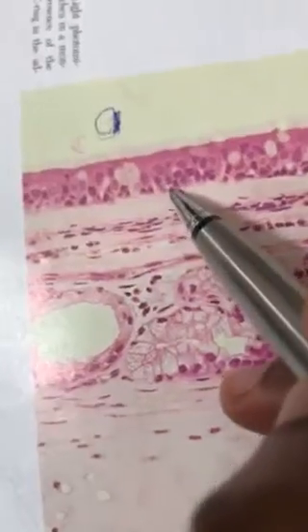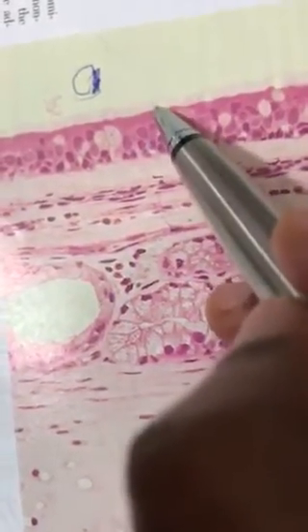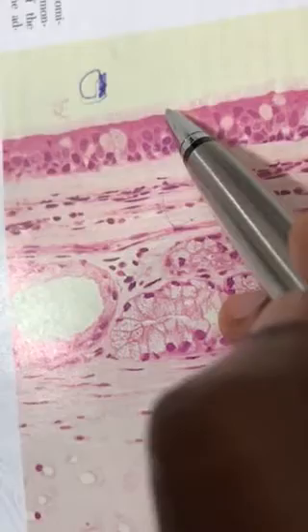Next is the trachea. Trachea is most important. When you see the trachea, we will ask you what is the lining. That is the pseudostratified ciliated columnar epithelium. What is cilia? Cilia is a surface elevation from the underlying cytoplasm. So this is cilia. What is the actual role of cilia?